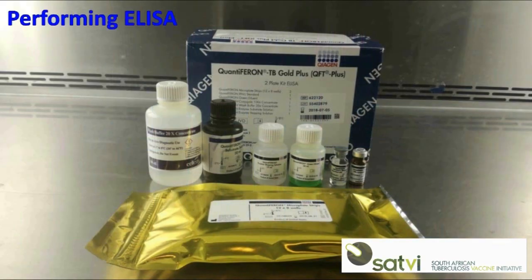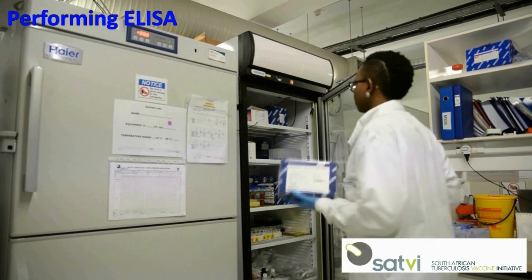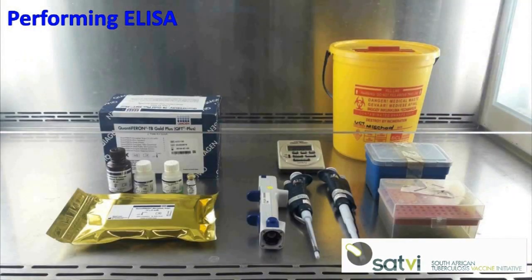The ELISA kit consists of two 96-well plates, a vial of lyophilized interferon gamma standard, a vial of lyophilized conjugate, green diluent, 20 times concentrated wash buffer, enzyme substrate solution, and enzyme stopping solution. Before starting the ELISA, all kit reagents must be brought to room temperature; the kit is removed from the fridge an hour before the start of the assay. The conjugate must be kept in the fridge until use.